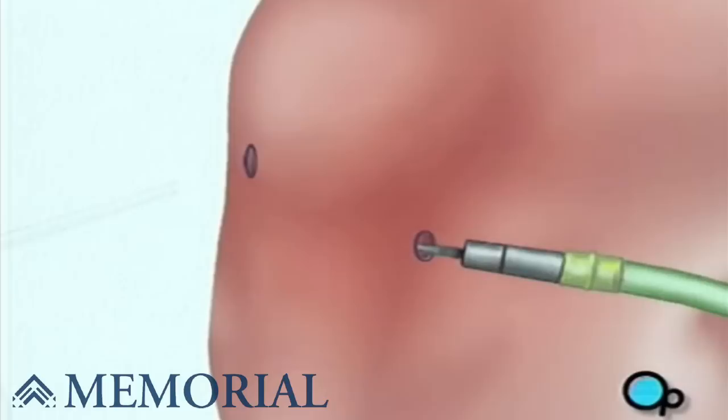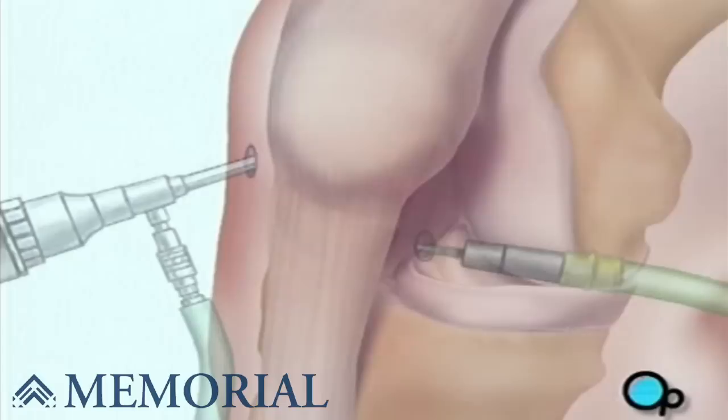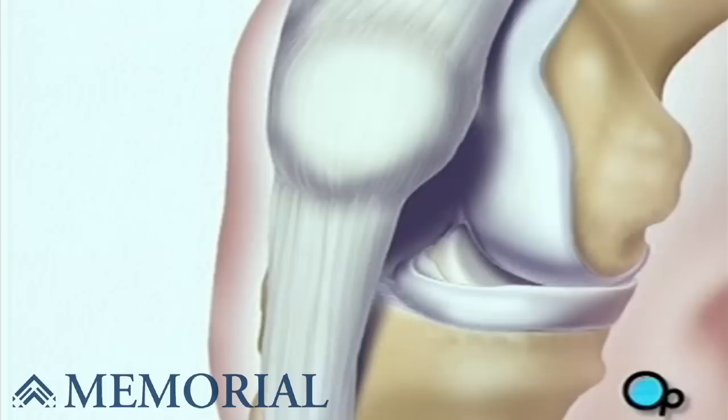The actual surgical instruments will be inserted through one or more other small openings. After verifying that the anterior cruciate ligament, or ACL, has been severed in the front of the knee, your doctor will begin the procedure by removing a piece of tissue from the front of the knee. This tissue, or graft, has bone on both ends and a section of tendon stretched between.